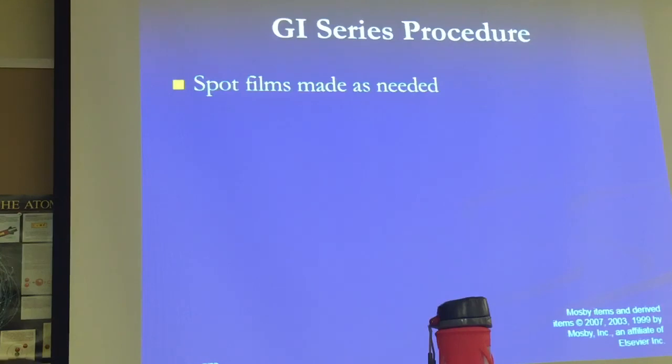Is it the same thing when you press save on the fluoro, that spot? Right. Have you seen, when they are doing that, this bright light? That's the picture. They stop the fluoro for 2 seconds, and then you see this bright light, the screen just lighting. That's the permanent picture. When you say save, if they are recording the whole fluoro case, they can also go back and save different frames. They can do that, but the quality is not as good as when they are doing spots. Okay.